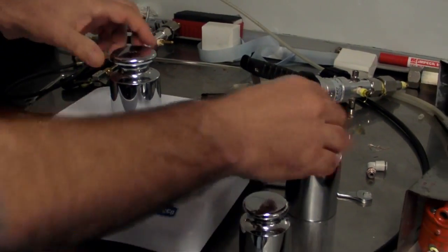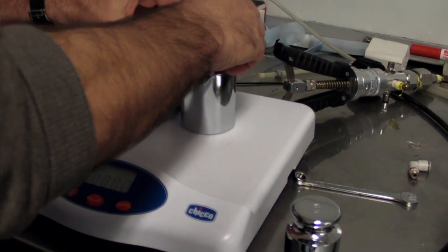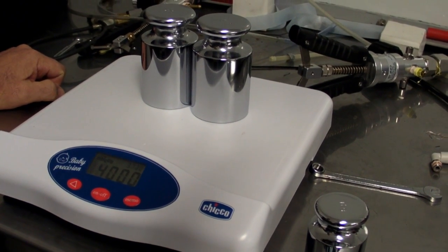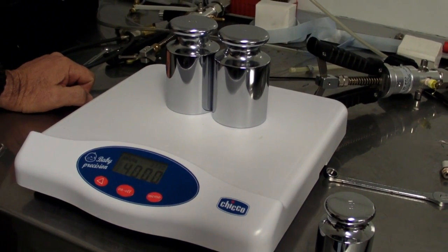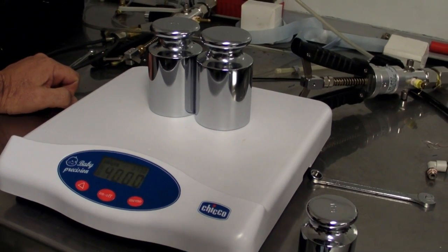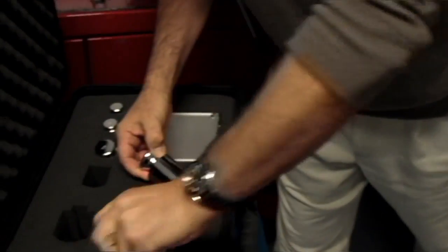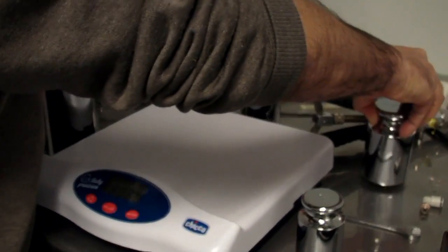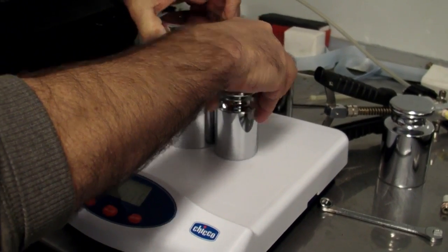We'll take it off, let it settle. Let's do it at four. Spot on. Not bad for a cheap set of Chinese scales — this is very good, I think we should use them in here. Let's take it up to six. Big six kilo weight. Five and one makes six — it's a long time since I've been to school, but I think it adds up.